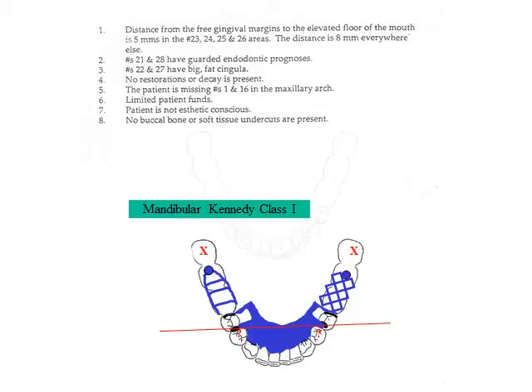Retention, if mesial, may be provided with wrought wire. If distal, a modified T may be used, or an I-bar if mid-buccal. The modified T provides greater frictional retention and is more efficiently located. The linguoplate, supported by cingulum rests, provides indirect retention.